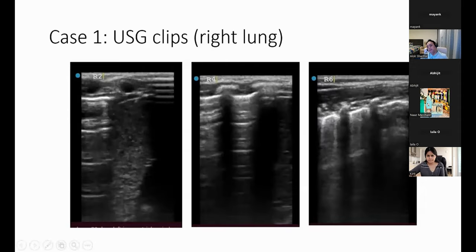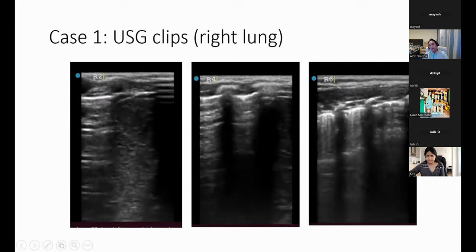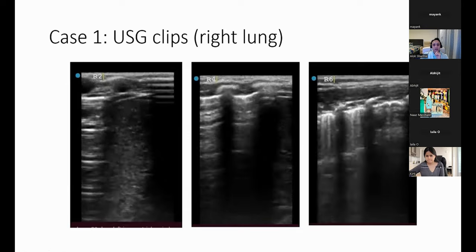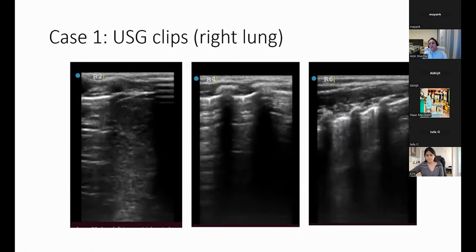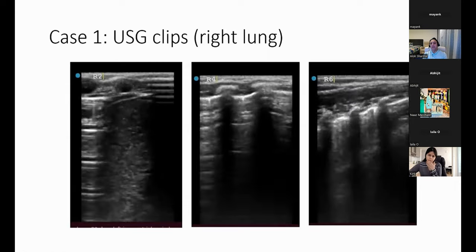A good way of preventing that from happening is putting a small towel under the baby's chest, so that rather than having a sloping back, because the back tends to slope, I mean, I tend to hunch a lot. So you might want to put a towel under the baby's chest to keep the back as straight as possible and maintain your contact.